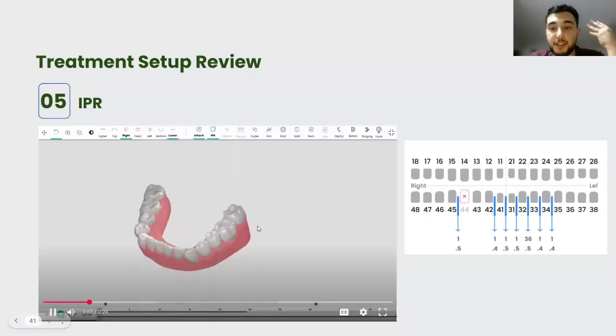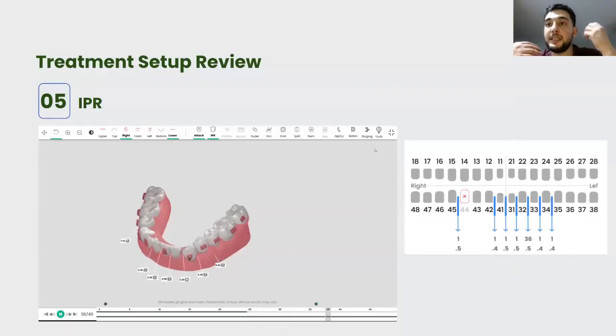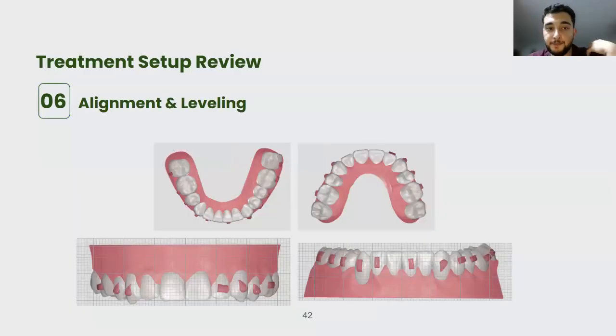And because the technician is not experienced clinically, they add the interproximal reduction at step 1. Of course, a lot of technicians are more qualified and mastered at these things because they have a lot of experience. But I'm saying in general, because you are the treating physician and you're the dentist controlling the case, it's always good to keep that in mind to avoid any mistakes or leaving things that go through the cracks.